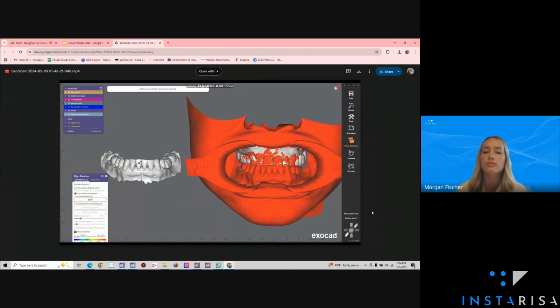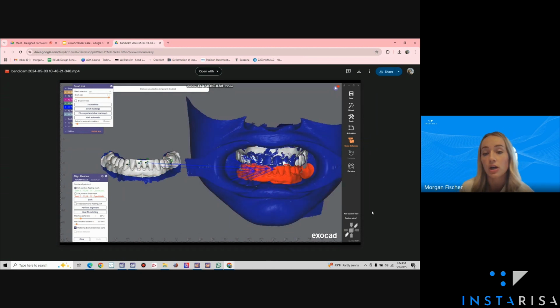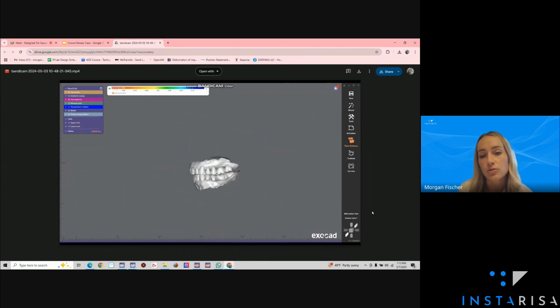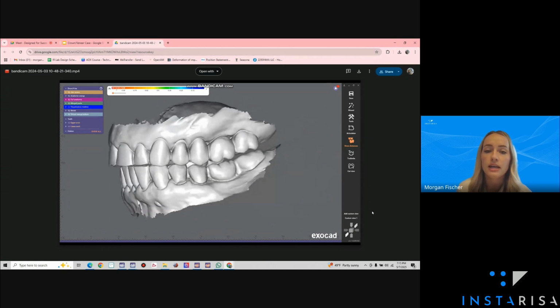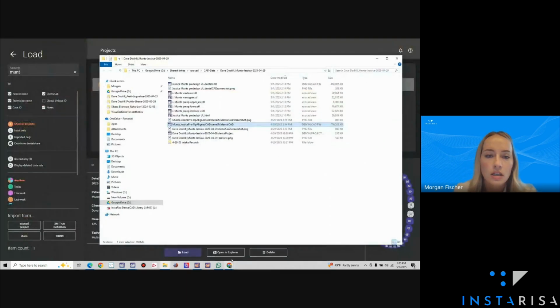In exocad, we're looking for camouflage here. You saw a lot of blue in that mesh. Blue is an exact one-to-one mesh, and I know that that means that my files are lining up properly. So here, instead of mounting this bite off of the intraoral scan bite from your Trios or your Prime scan, it looks like in this instance, this bite was opened a couple millimeters, which is great, because anytime we're opening a bite with an intraoral scan, it can be extremely challenging if you're opening the bite more than just a couple millimeters.